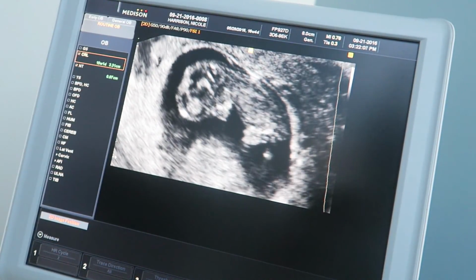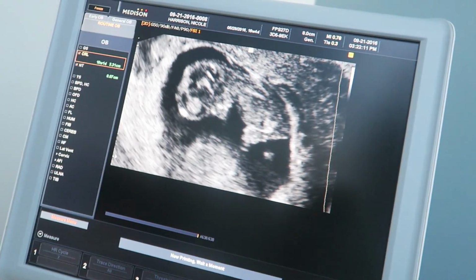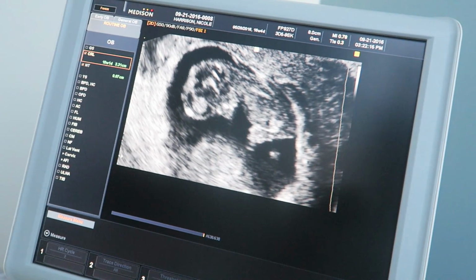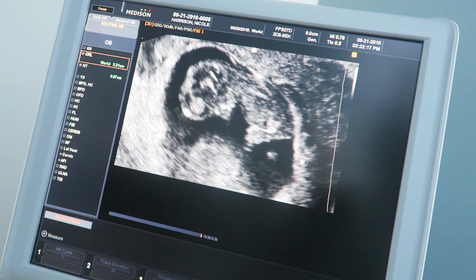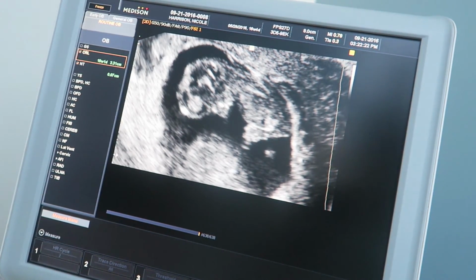There's not another one in there, right? No, I checked the corners, although I need to document it. But the other reason why I wanted to come vaginal is, again, there's different issues at different stages. And the biggest issue at this late embryonic fetal stage is the space behind the neck.